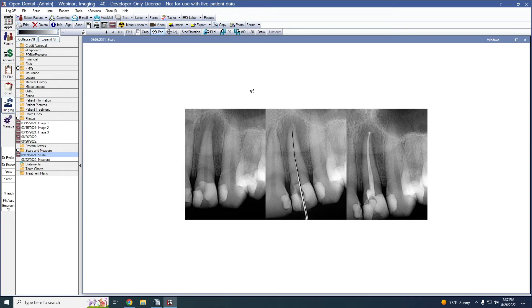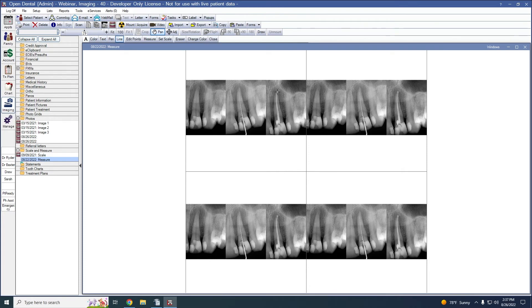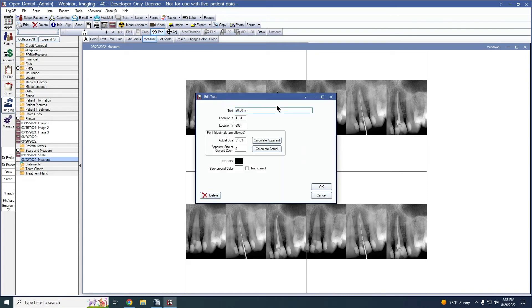Once we've set the scale, we can measure the length of lines drawn onto our images. Select the mount and acquire your images into a mount where we have set the scale. Once you've acquired your images, click Draw and Line and draw the line you'd like to measure. We can use Edit Points to make our line follow a curve. Once we're happy with our line, we can click Measure and select the line. The measurement will appear on our image, and from the Edit Text window, we can edit the text that will display on our image, its x and y position on the image, as well as the font size, the text color, and its background color. We can also choose to make the background of our text transparent.